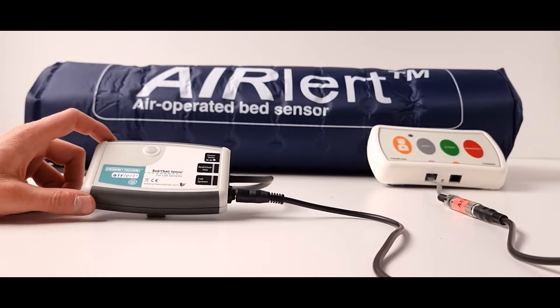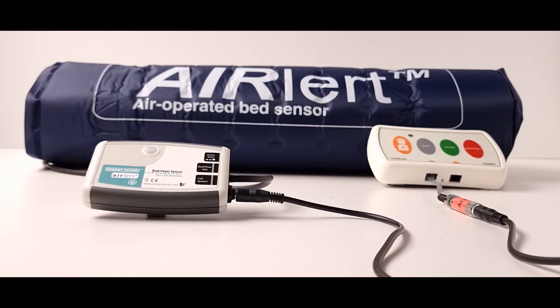The AirLert bed leaving sensor is used for fall prevention and will activate the nurse call system to alert staff that a patient has got out of bed.